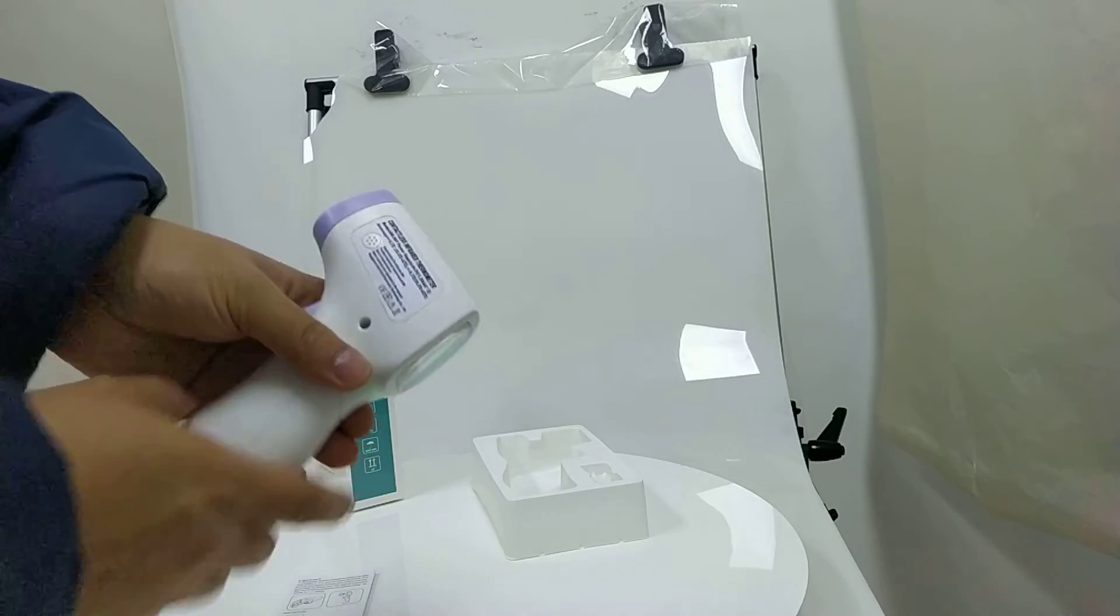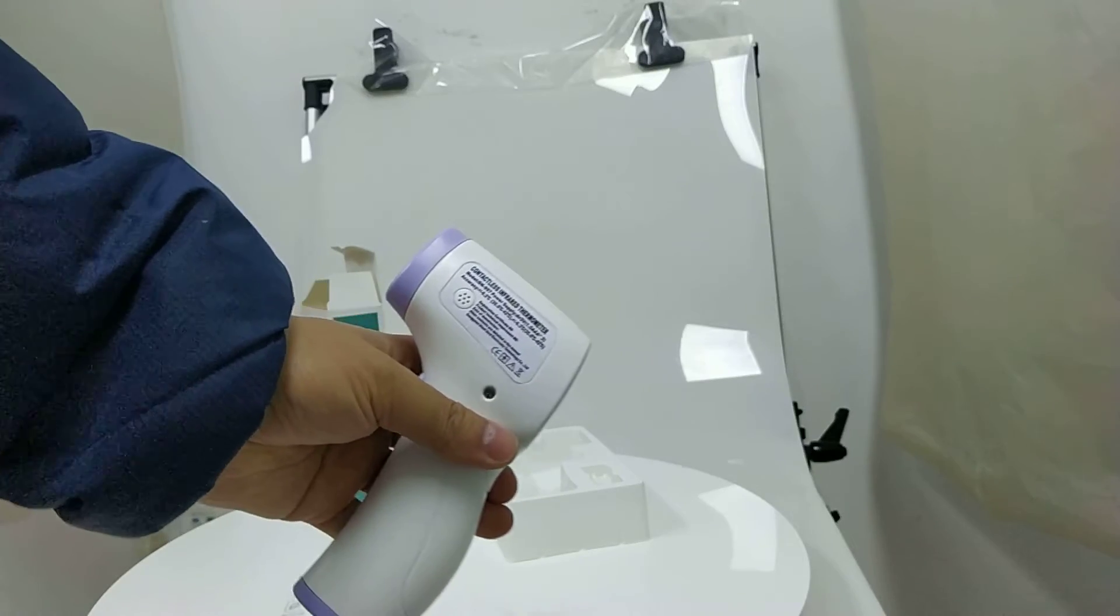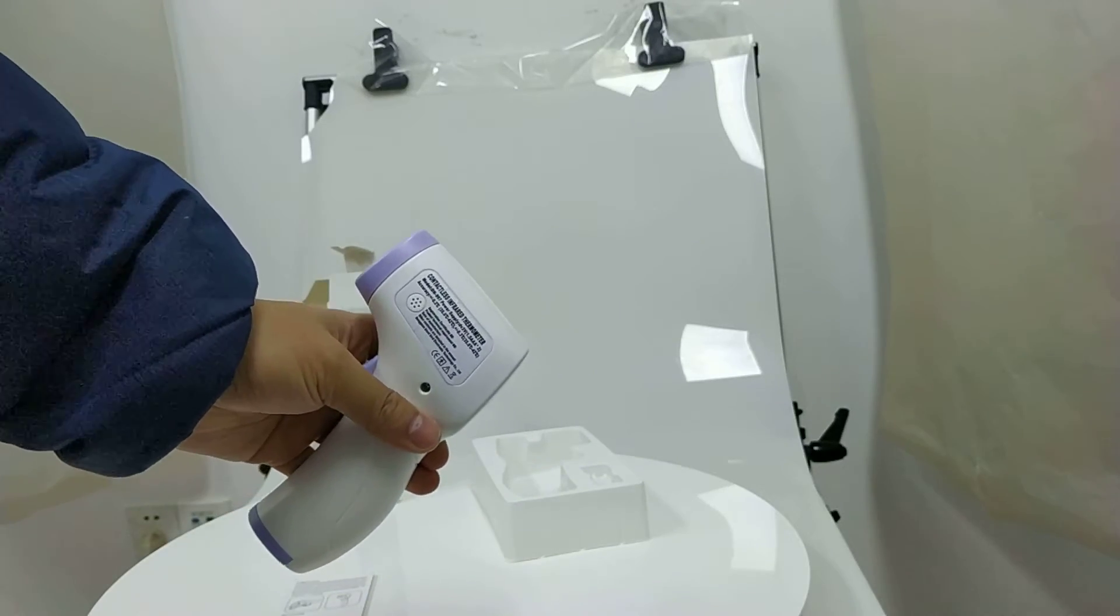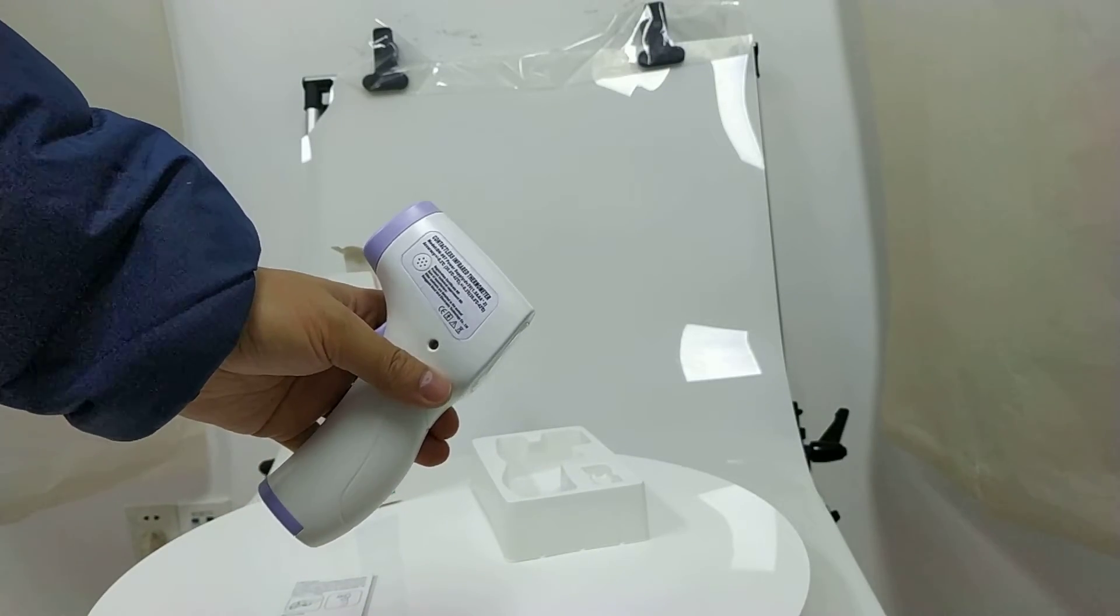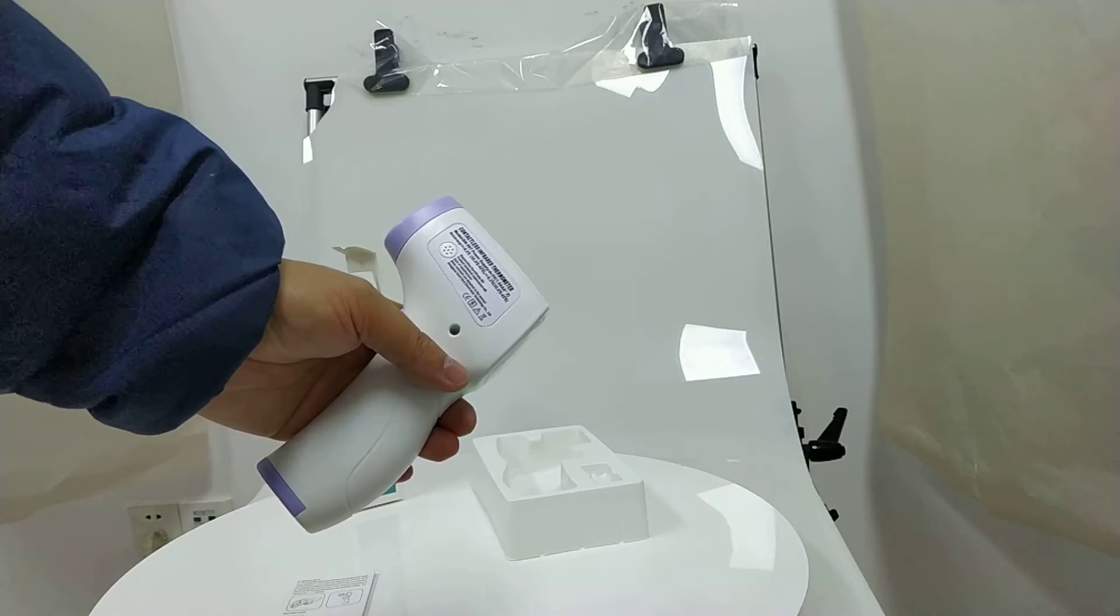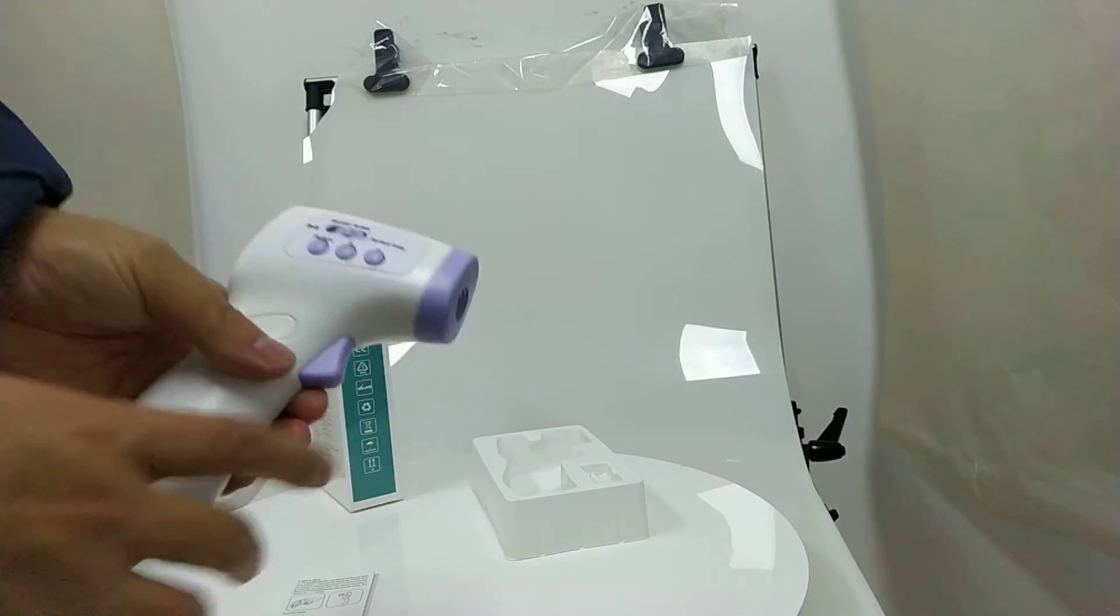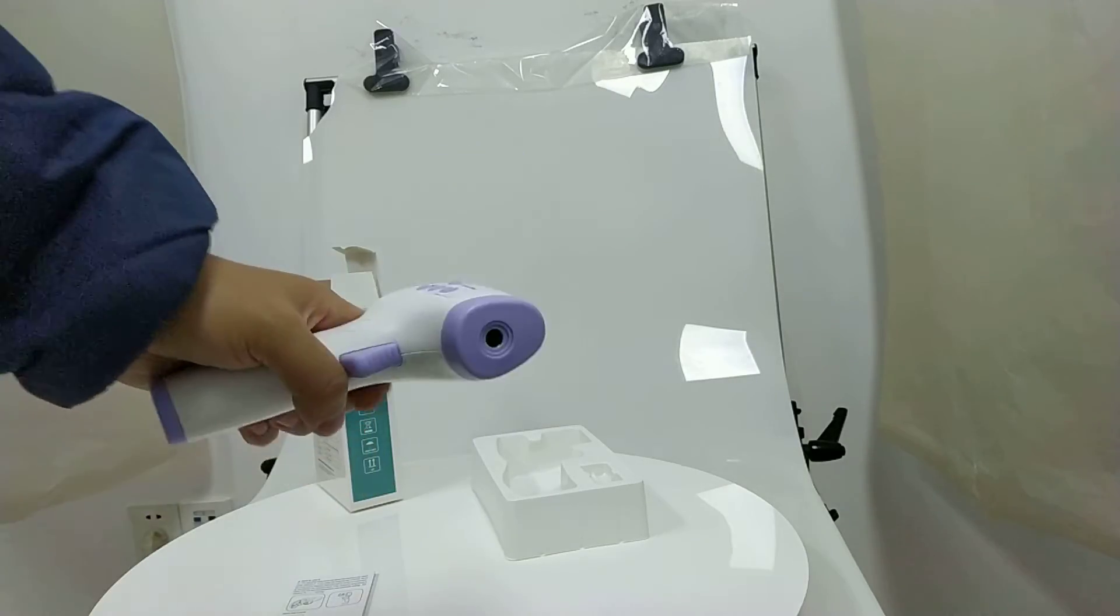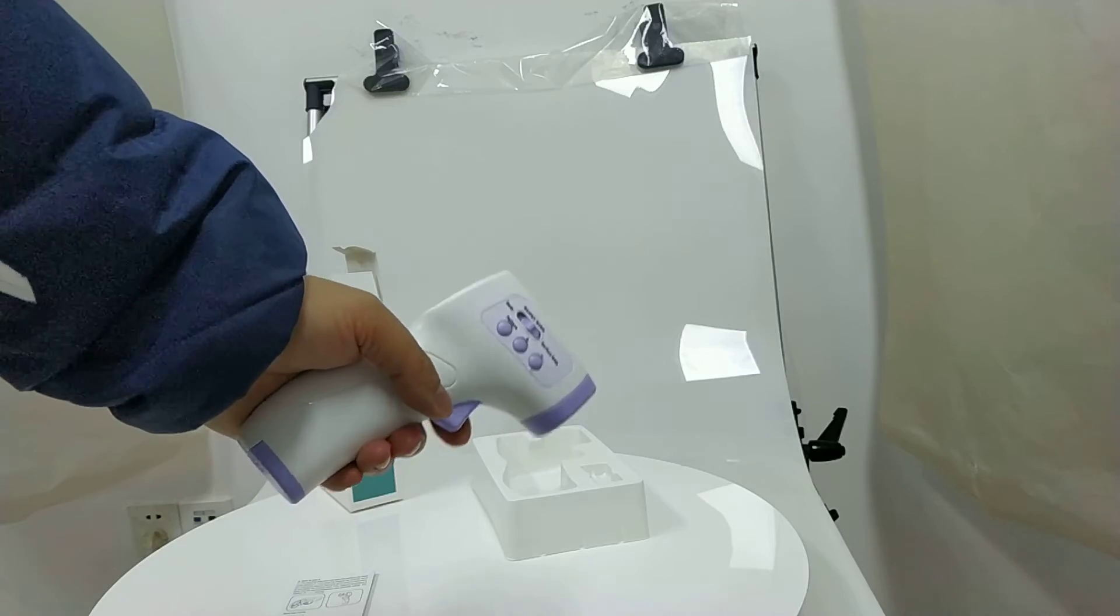So this one is better than the normal thermometers, which can just measure for 1 or 2 cm.